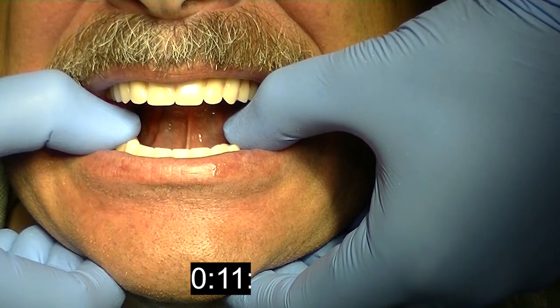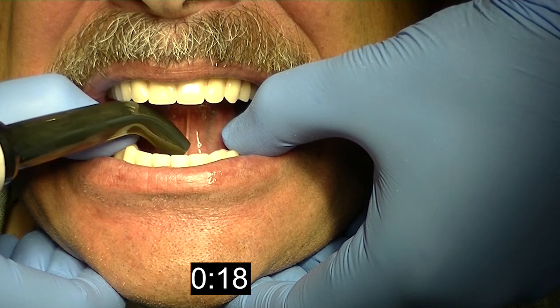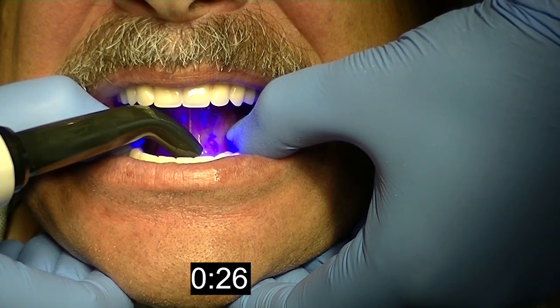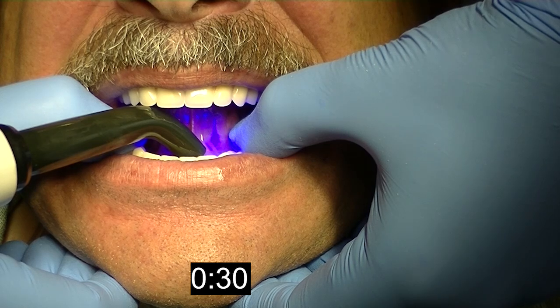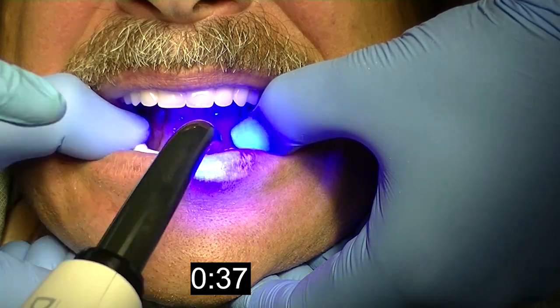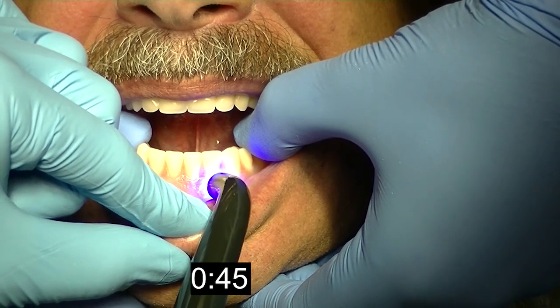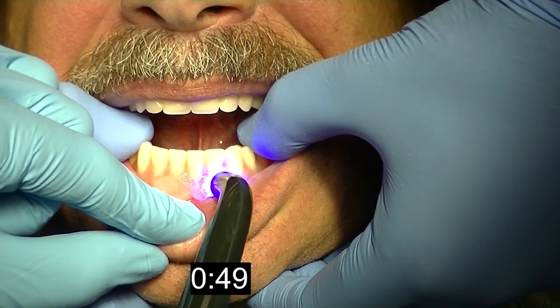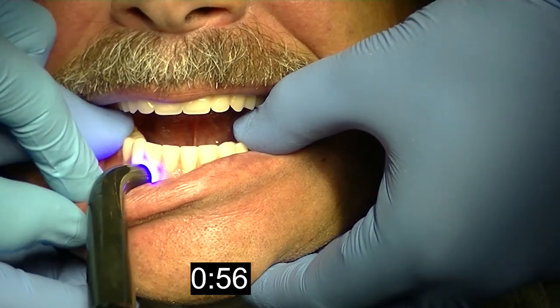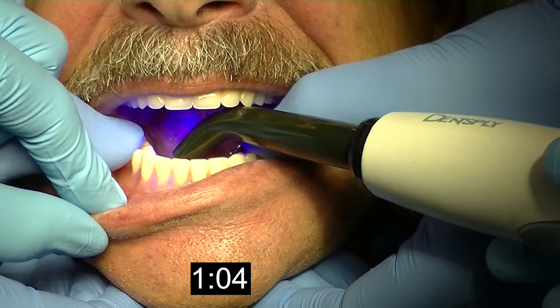What I like to do is give the chair side attachment processing material about 30 seconds in the mouth prior to initiating it with a light curing unit. This material is a dual-cured material with a true light-cured component, meaning that — unlike some other materials on the market where the light cure merely adds heat to accelerate the curing step — this material is actually activated by the light, dramatically reducing the amount of time in the mouth and increasing efficiency. I like to go ahead and cure from the buccal and lingual slopes, 20 seconds from the lingual and 20 seconds from the facial of each particular attachment. I find this is a very effective technique in all of the patients I've treated with this material.